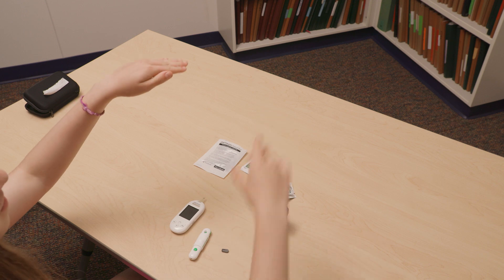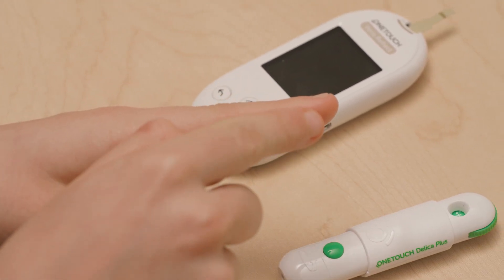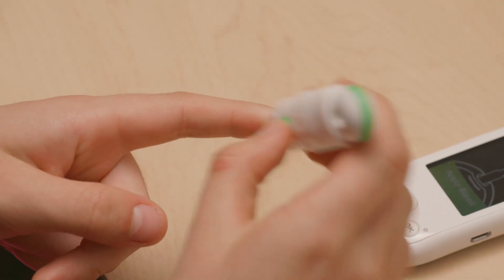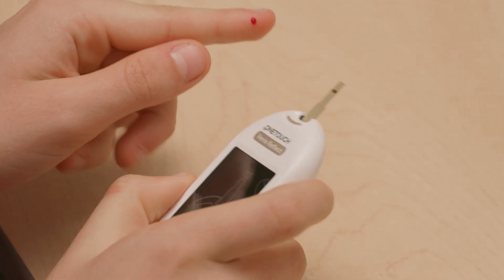Hold your finger below heart level. Try not to use the very middle or tips of fingers — there is more feeling in these areas so it can hurt a little more. Place the lancing device firmly on the side of the finger and press the green button. Squeeze from the palm of the hand down to the tip of the finger to get the blood drop to come out.